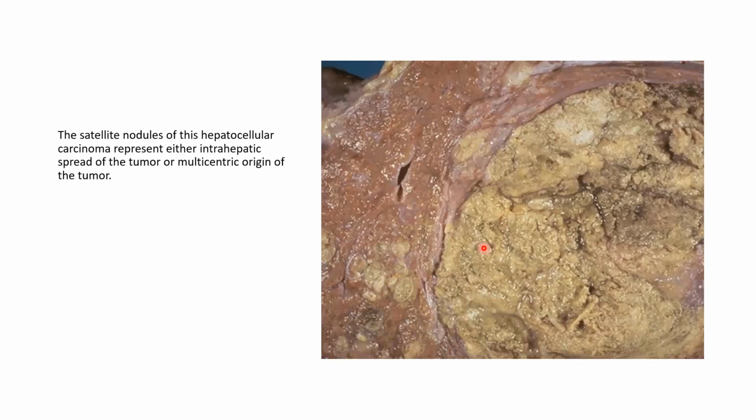This is a case of hepatocellular carcinoma. This is the main tumor mass, shown here in yellow, and a lot of what we call satellite nodules. If you remember, we talked about the risk of intrahepatic dissemination or intrahepatic spread: HCC enters blood vessels and implants at another site in the liver, like these small satellite nodules. All of these are HCCs that came from the primary big HCC.